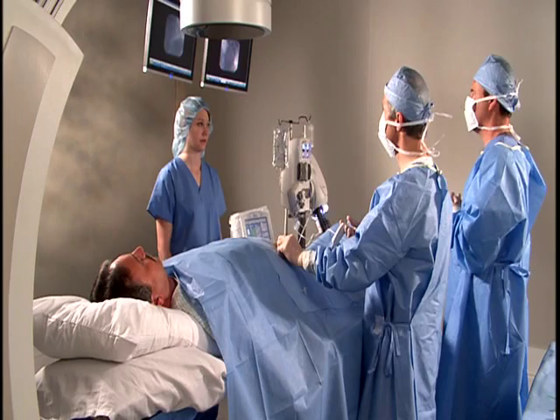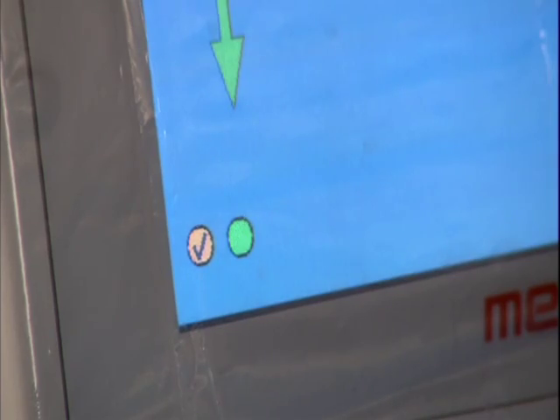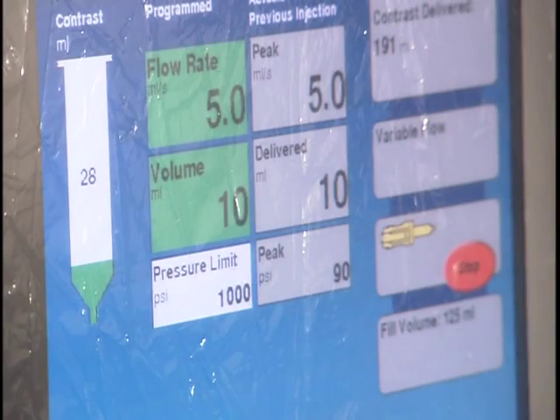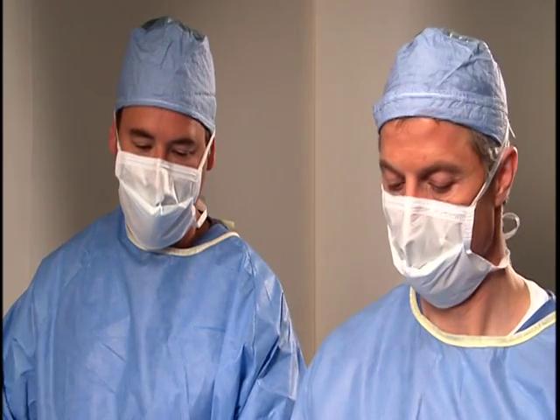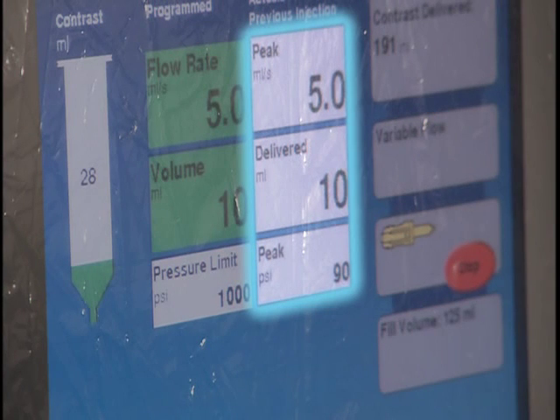To initiate an injection, depress and hold the hand controller or foot switch. The fluid delivery indicator flashes green when injecting contrast and flashes blue when injecting saline. The volume remaining syringe icon decreases during the injection. When the injection is complete, the system disarms unless it was set to multi-arm previously. The end of the injection is indicated by an audible tone. The DCU will show the actual achieved flow rate, the delivered volume, and the maximum pressure generated during the injection.